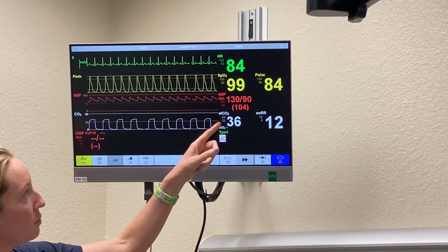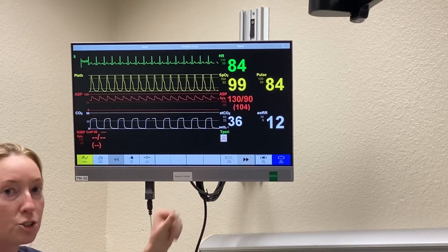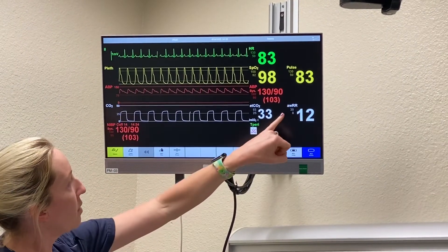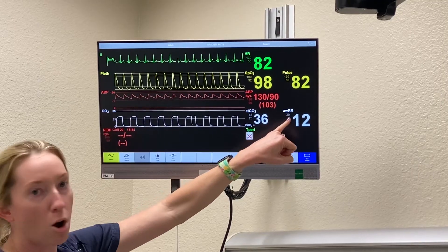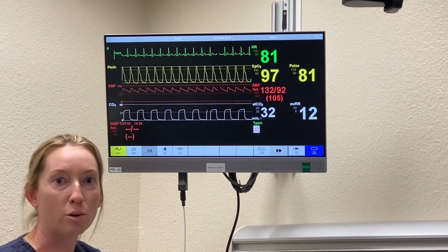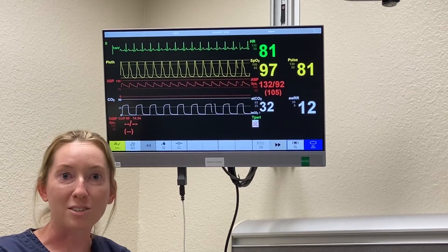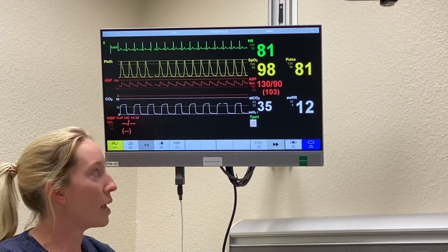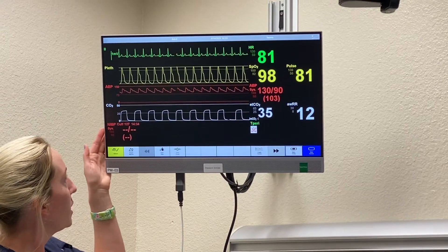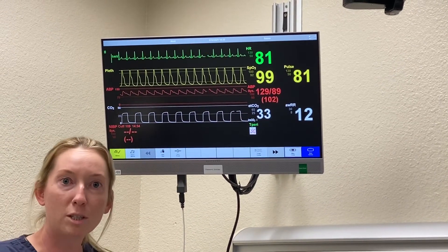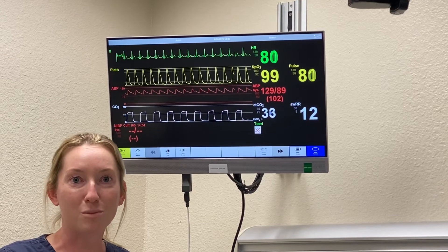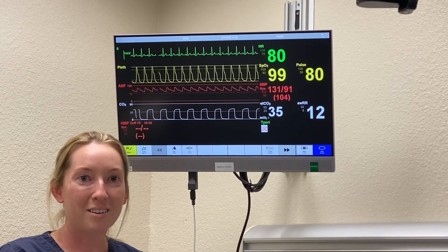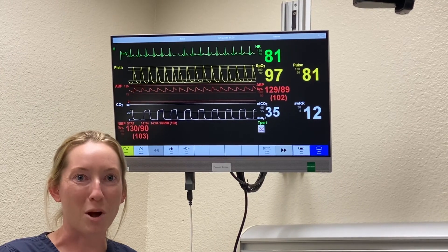Over here we have ETCO2 — that is your end tidal CO2. And then we have AWRR, that is your airway respiratory rate, otherwise known as the respiratory rate of the patient — how often they are breathing. Like I said, these may change depending on the monitor that you're looking at; the colors may change, the placement of the vitals may change. But overall, that is a real quick get-to-know-your vital signs monitor. Thanks!